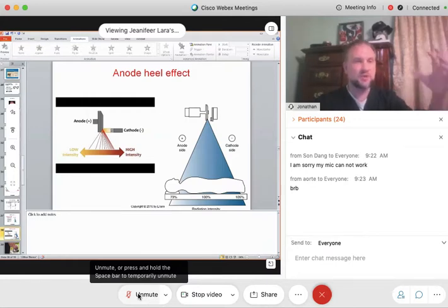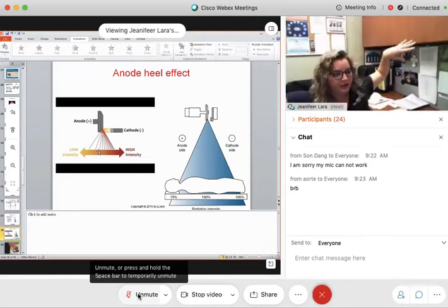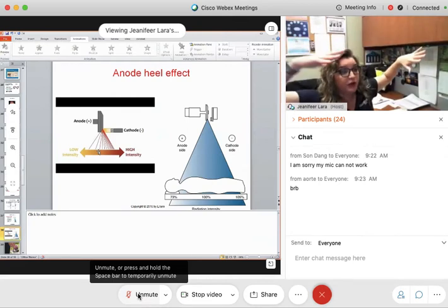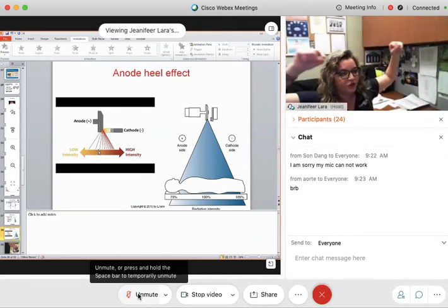Is that just because they're not strong enough to penetrate the skin? Think of it like an army: if all of the soldiers are different strengths, not all of the X-rays will possess the same energy, and we're going to talk about why in the next chapter.